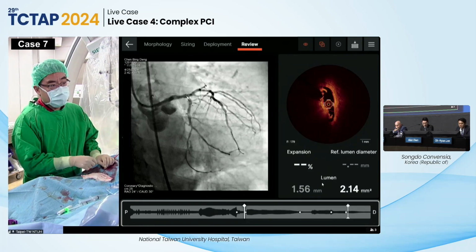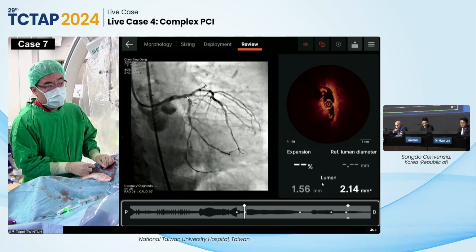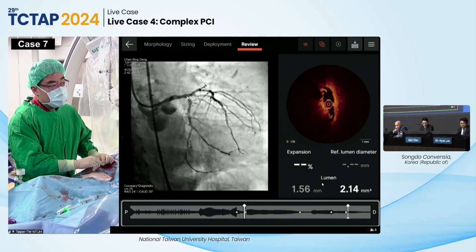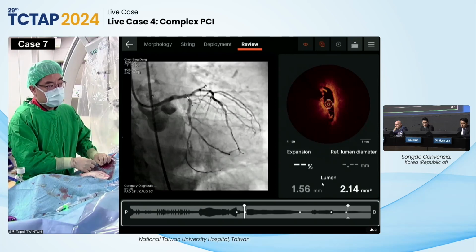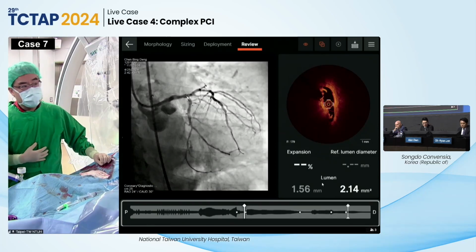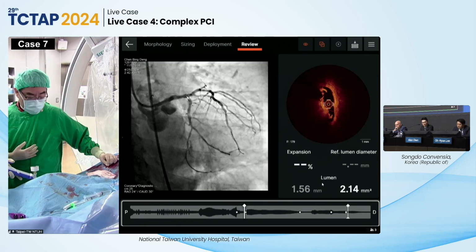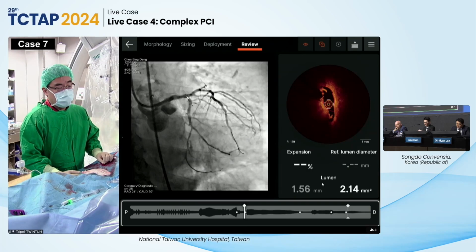But like I explained earlier, my hope is to be able to do a crossover stenting. With all these devices available right now, we have this luxury. So we can just continue the intervention until the final result tells us whether this goal or strategy is possible or not. Of course, I can do a two-stent strategy right now, put in a stent in the circumflex and then culotte the LAD.